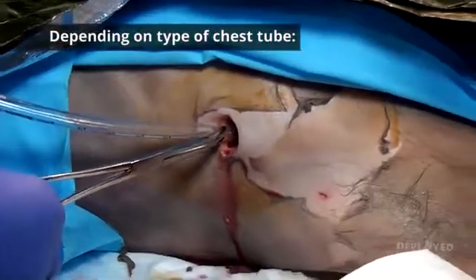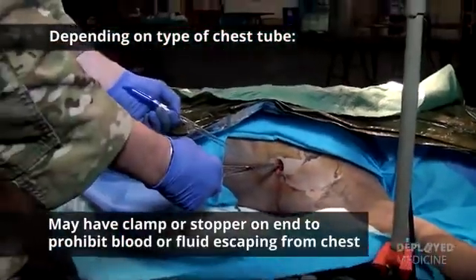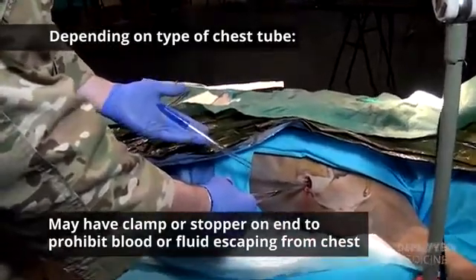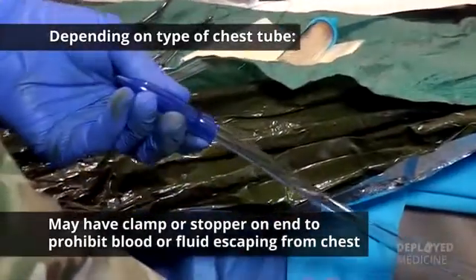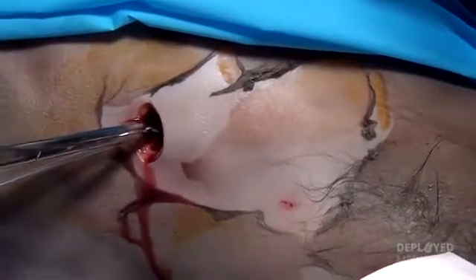Depending on what type of chest tube you may have, a clamp down here at the end that may be stopping any sort of fluid or blood from escaping from the chest. This chest tube itself does not require it. This blue device down here stops any sort of blood from escaping through the chest tube from the chest cavity.